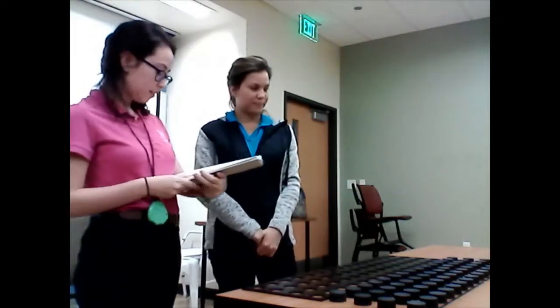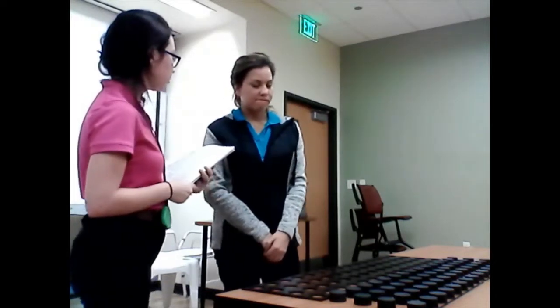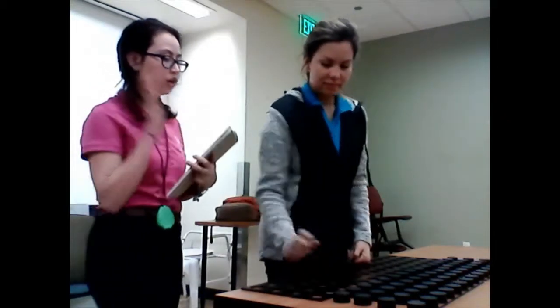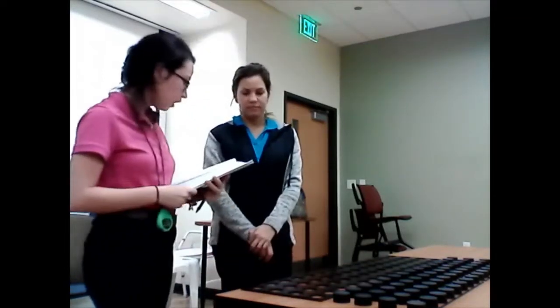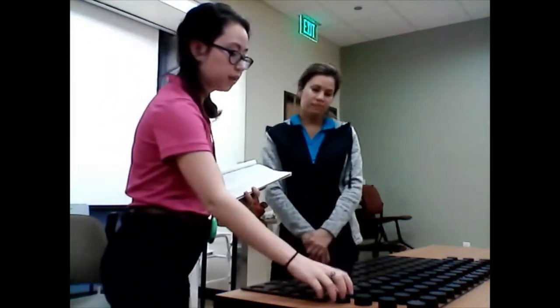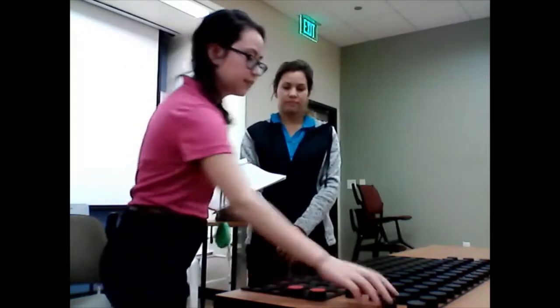Okay. This test is called the one-hand turning and placing test. Do you remember how the regular placing test was? Remember this one? Yes. You're going to follow that same pattern of bottom to top and following the column down. This time around, however, with one hand, you're going to pick up the peg, turn it over, and place it in the hole. Just like this.